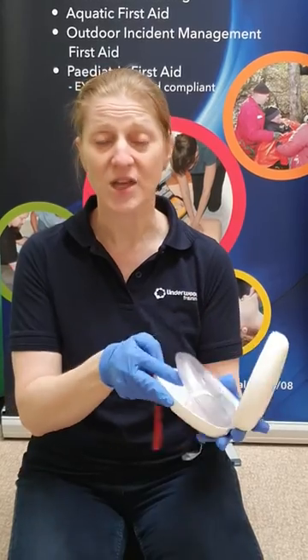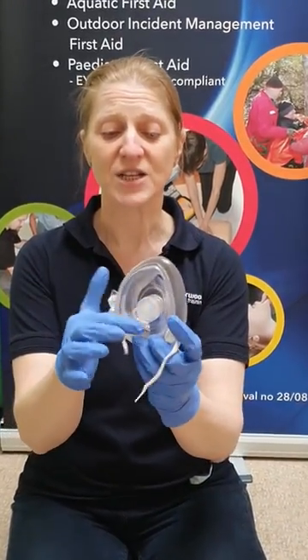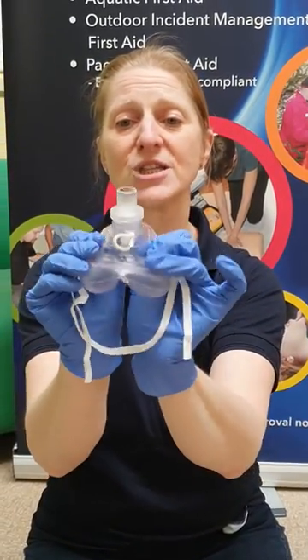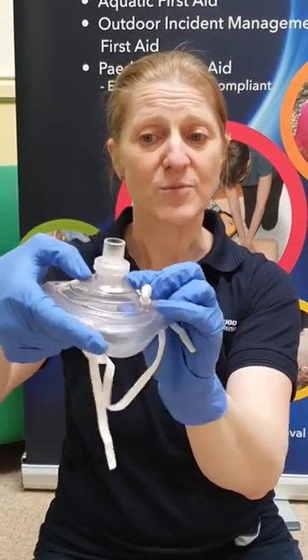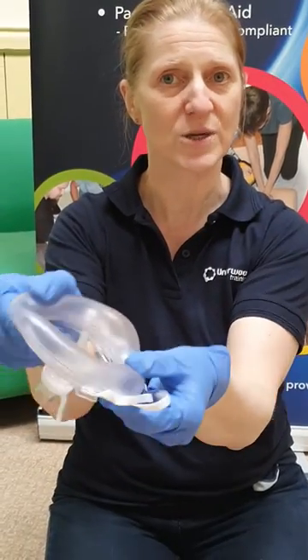So this is a pocket mask. They come in a little clamshell, so what we need to do is open them up, and you'll find there's a little nozzly thing that needs to point up to the sky, and then we're going to push up underneath to push the mask into a dome. As a top tip, if you push on the dome you'll flat pack it again, so make sure you're pressing on this nice squidgy cuff.